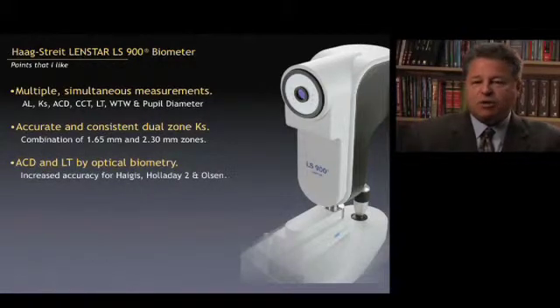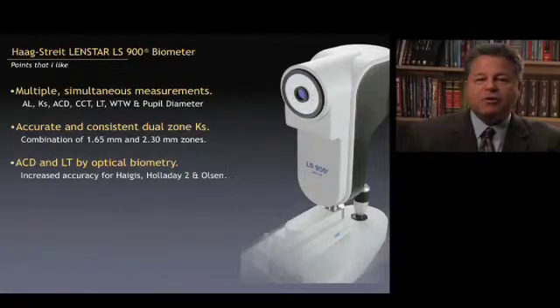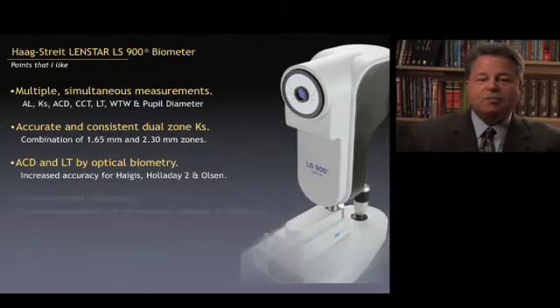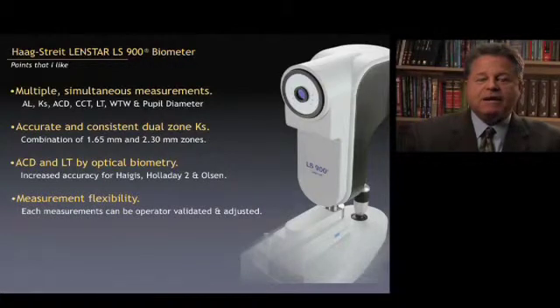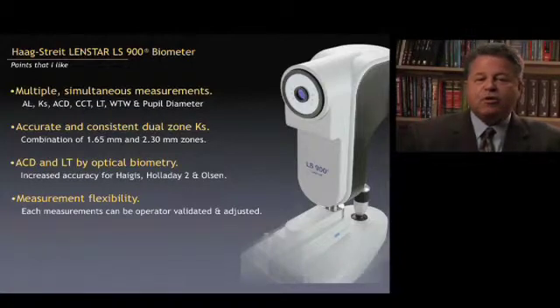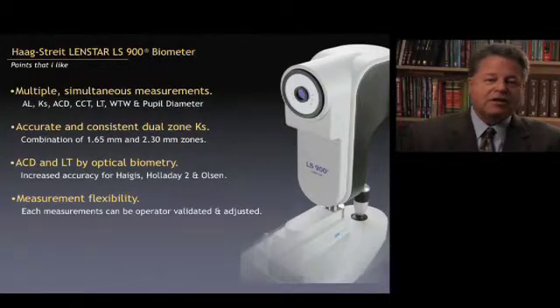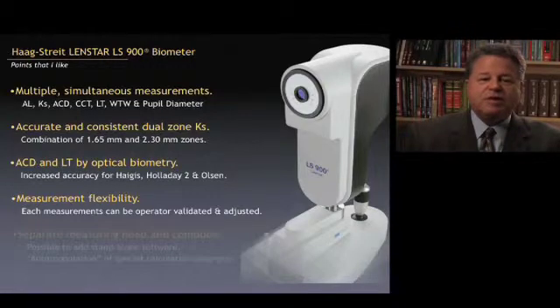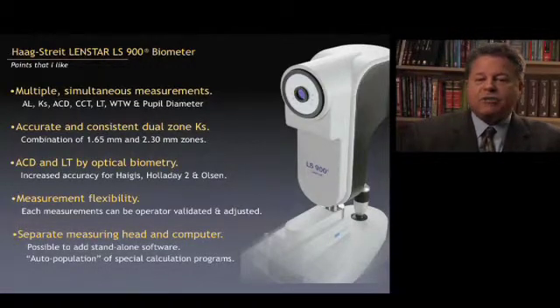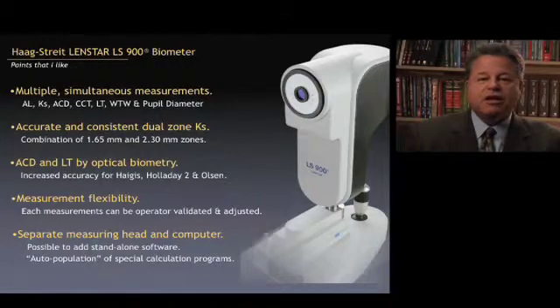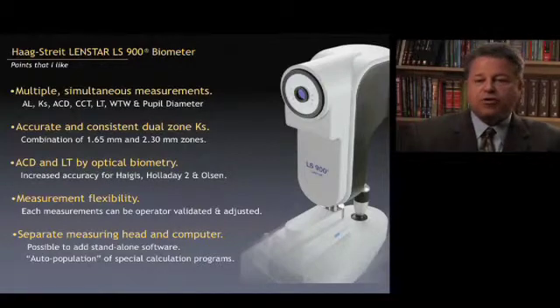The anterior chamber depth and lens thickness are measured by optical biometry, which is very important for some of the newer and more accurate formulas such as Haigis, Holladay 2, and Dr. Olsen's PhacoOptics formula. Each measurement can be operator-validated and adjusted — very important to make sure the measurements are correct. The measuring head and computer are separate, making it possible to add stand-alone software such as the Holladay IOL Consultant, with bridges written between the iSuite software of the LenStar and programs like the Holladay IOL Consultant and Dr. Olsen's PhacoOptics, so the two programs can talk together and auto-populate.